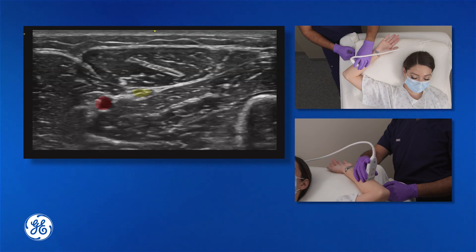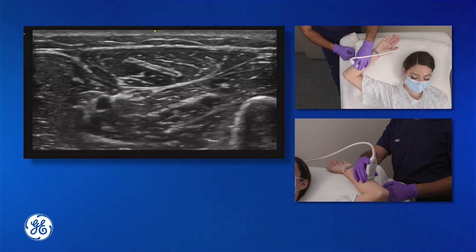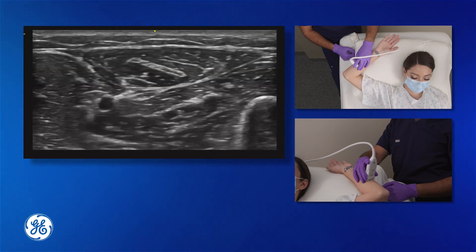We'll move more proximally such that the ulnar artery and the ulnar nerve separate from one another. At this location, the ulnar nerve and the ulnar artery are distinct from one another, providing a safe region for us to perform the block.